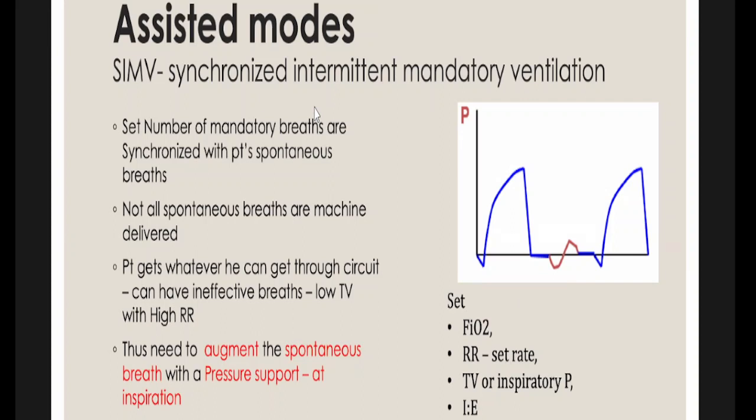So these are the set numbers on the ventilator, where if you want to set up a SIMV mode, these are the parameters that you have to feed in. I'll discuss PEEP and trigger sensitivity in a little while.